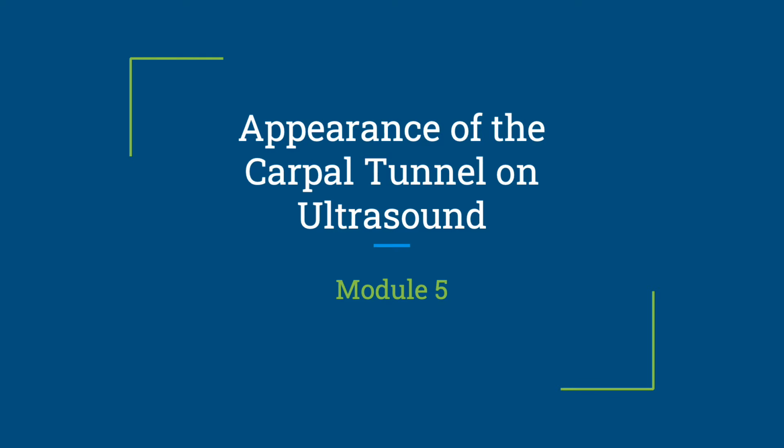This is Module 5 of our online educational program. It is going to talk about the appearance of the carpal tunnel on ultrasound.